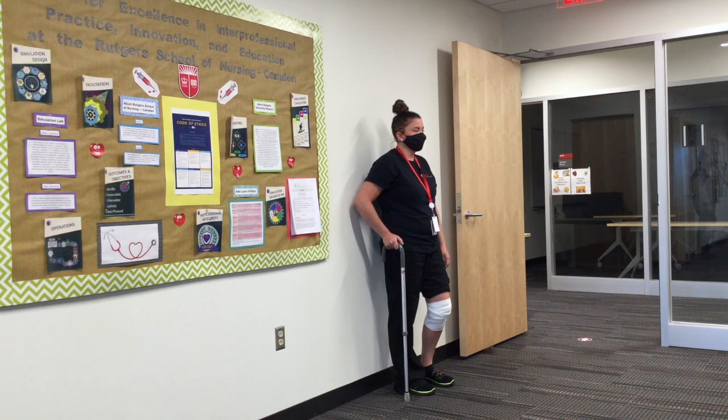The patient's elbow should be flexed at 15 to 30 degrees, and the cane handle should fit comfortably in the patient's hand.